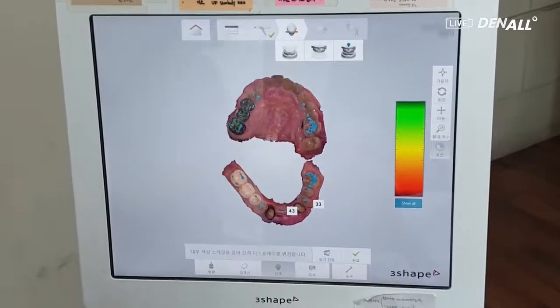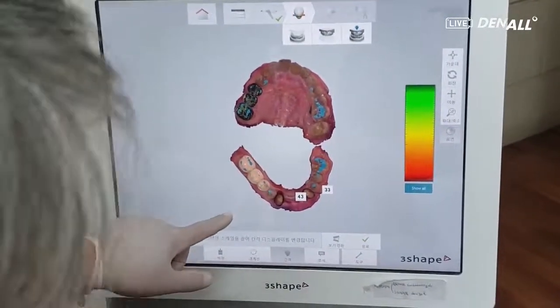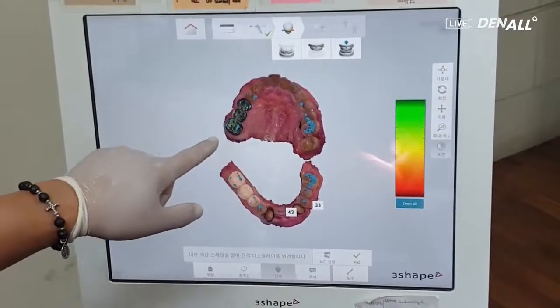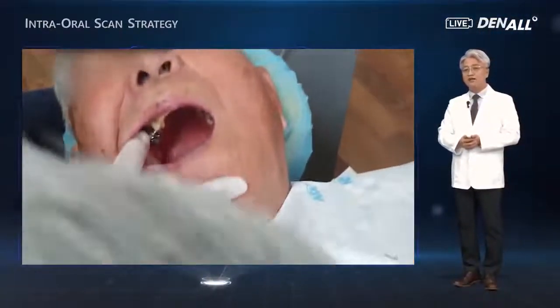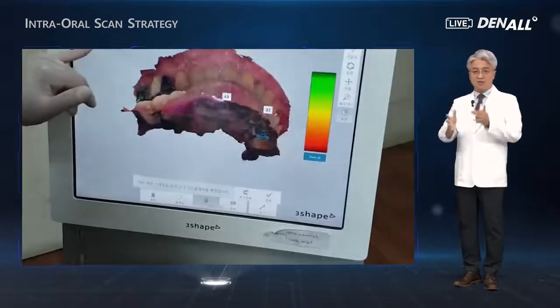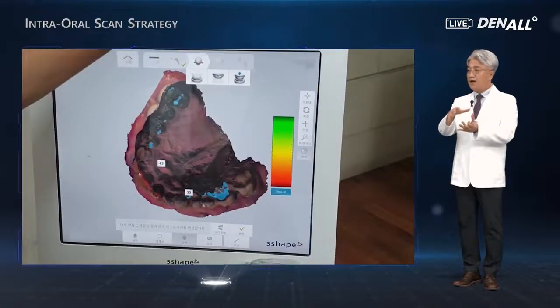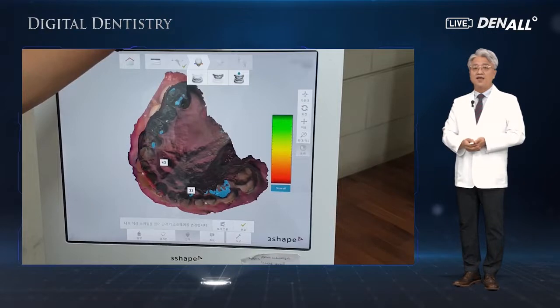Another important advantage of digital is that patients can look at the contact points directly themselves. Before scanning, have the patient bite on articulation paper. Articulation marks would be obtained and compared to the ones in the digital model. If they are similar or consistent, the accuracy of the bite vertical dimension or occlusion can be verified one more time.